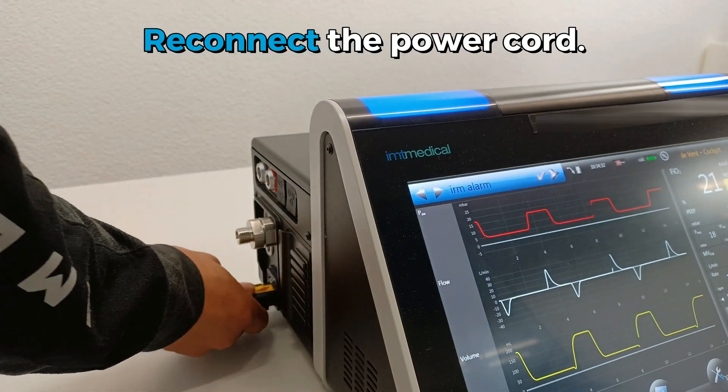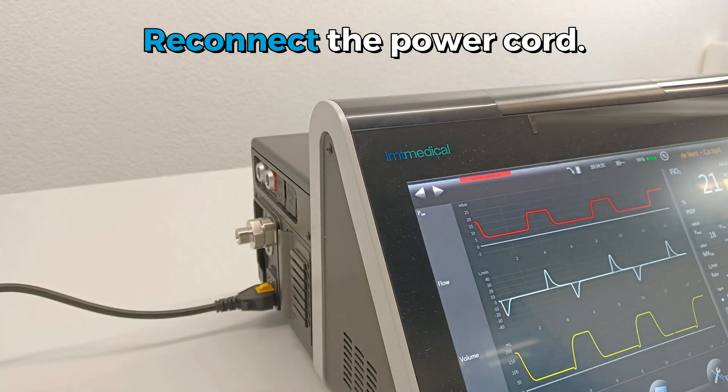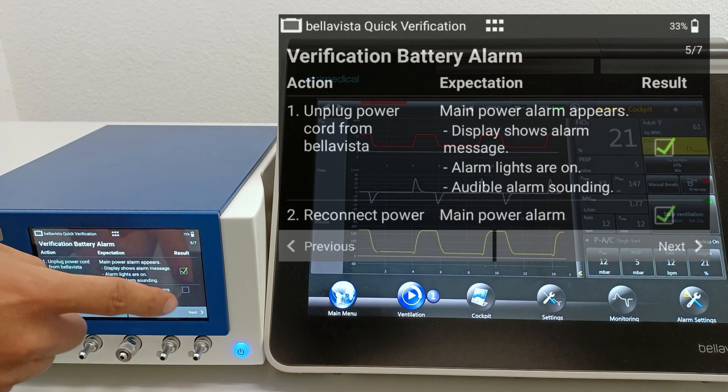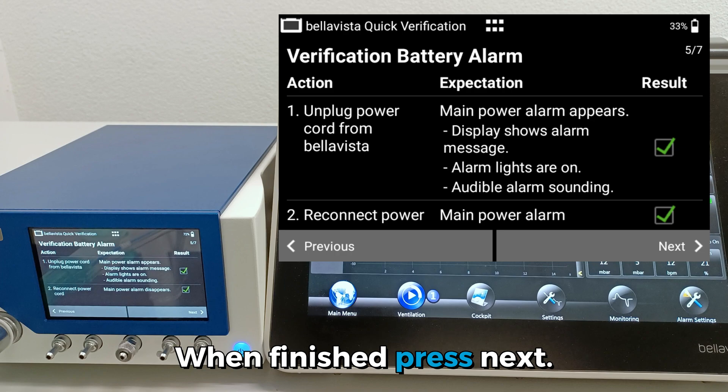Perform Action Number 2. When finished, press Next.